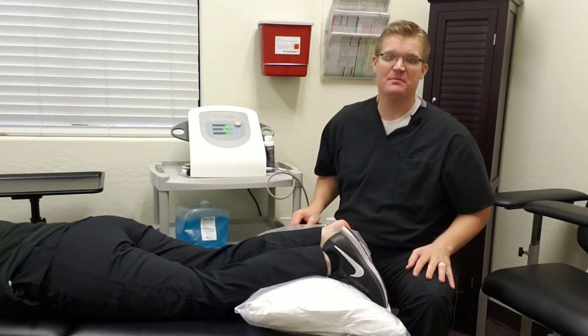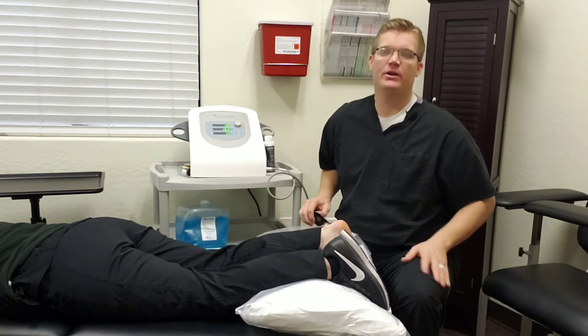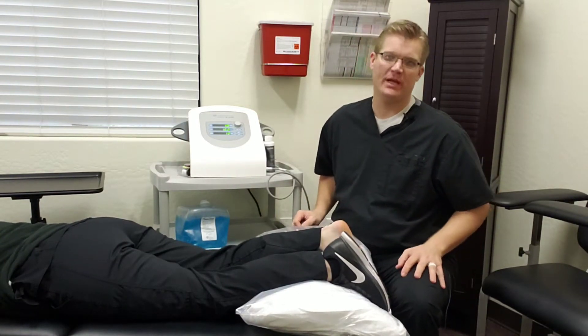Hello guys, my name is Dr. Scott Taylor from Southwest Fighting and Rehab, and today we are doing a demonstration video on radial pressure wave therapy.